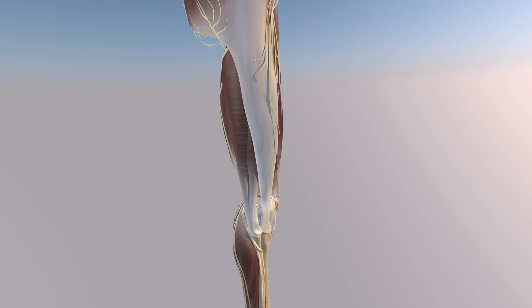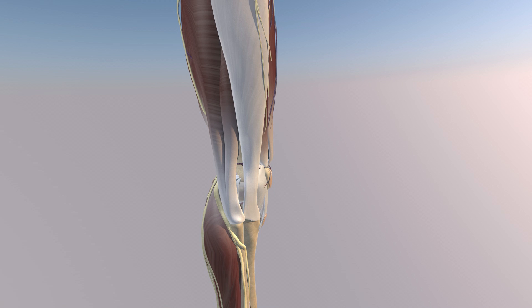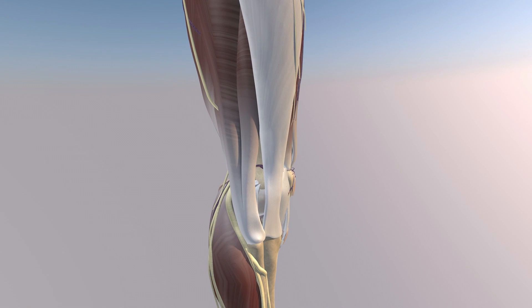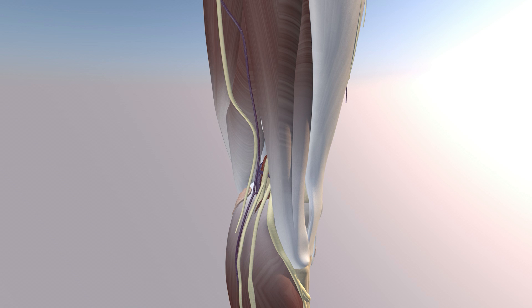Here we're going to focus on anatomy of the lateral knee and lateral thigh, focusing in on the knee. We can see the iliotibial band and the biceps femoris muscles — both the short and the long head. You can also appreciate the semimembranosus muscle and semitendinosus muscle above that.